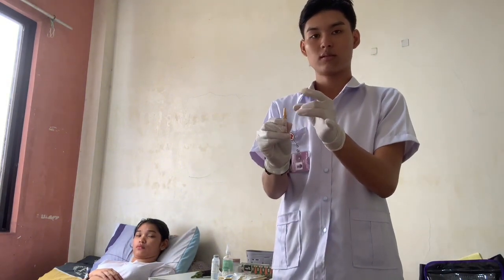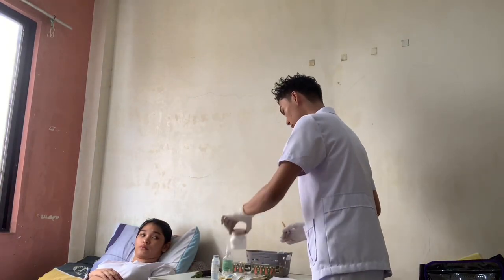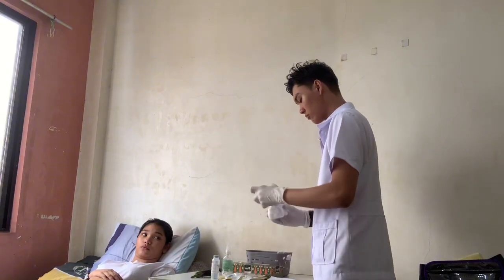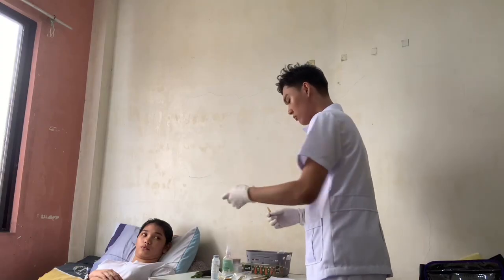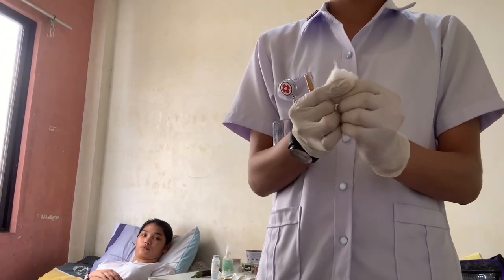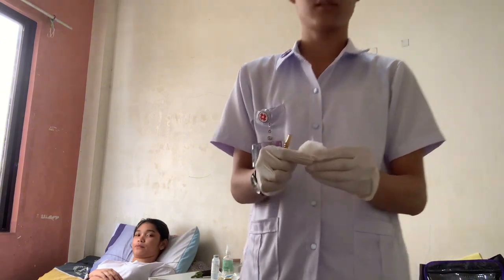After that, flick the stem a couple of times. And then I have here a cotton ball. I will put it at the top of the ampule. And remember, if you break the ampule, break it away from you and away from the people, just for caution.